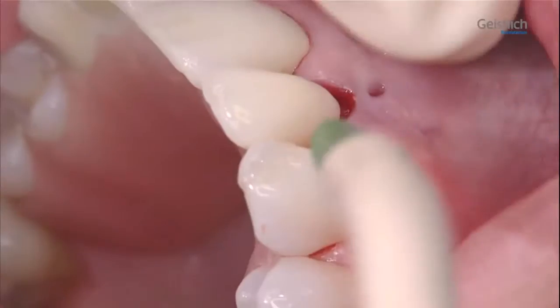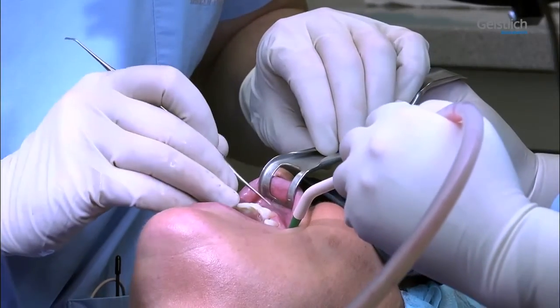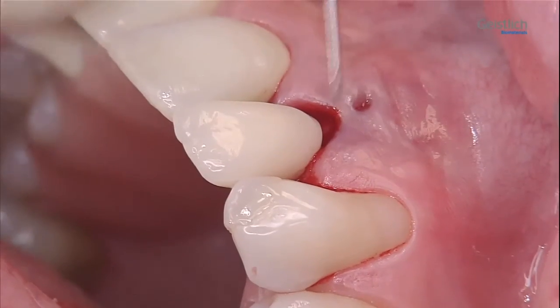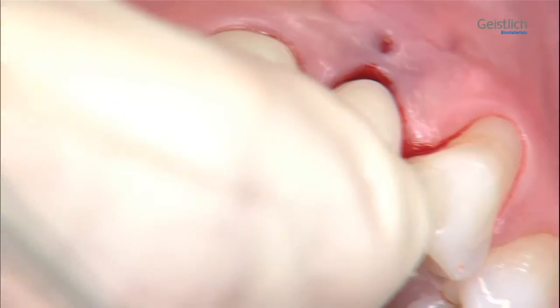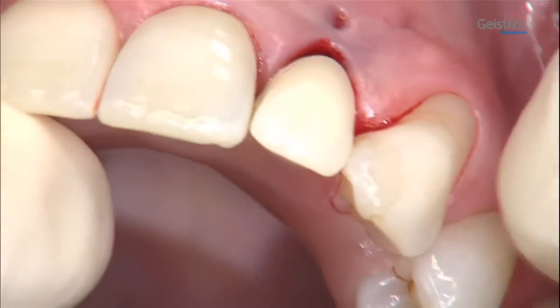Finally, the previously fabricated provisional is introduced and checked for proper fitting. In the present case, the provisional is extended in the apical region to ensure a satisfactory functional and aesthetic result.